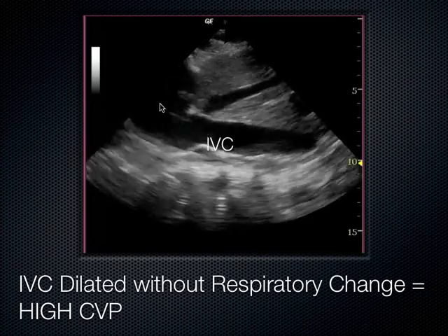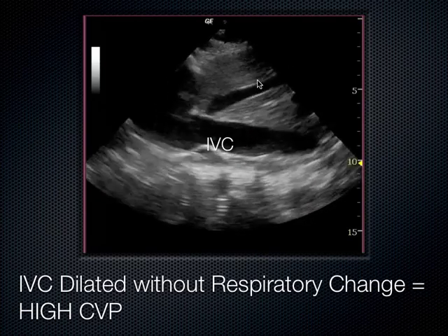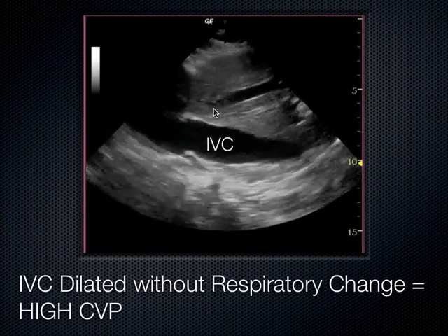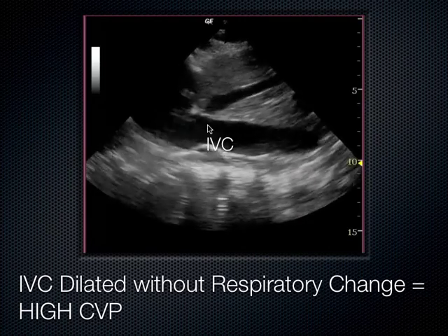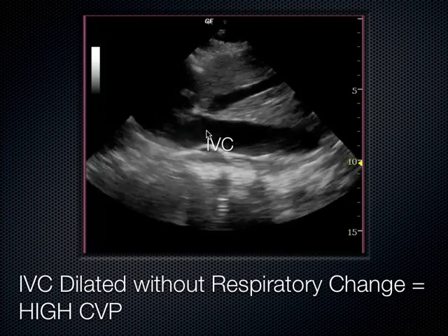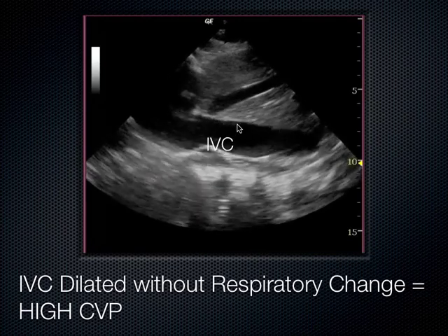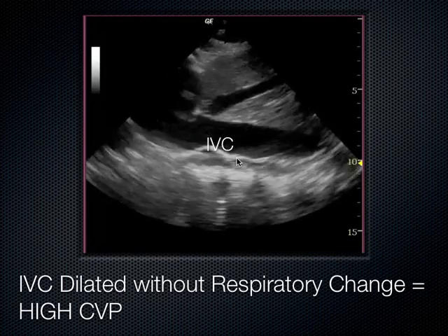This is the heart right here. This is the right atrium of the heart. Here's the IVC coming across the screen underneath the liver. This is the hepatic vein right here. People always say, well, where do I measure the IVC? Over here, over here, over here. Hotly debated topic. Probably 2 centimeters distally to where the hepatic vein dumps into the IVC. So that would be maybe around here is where most people agree to measure the IVC diameter.